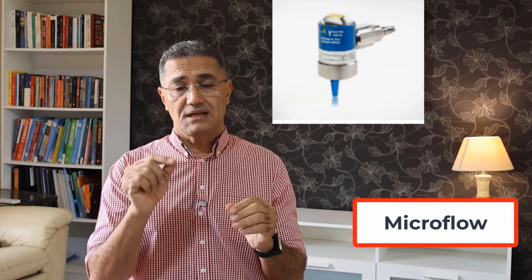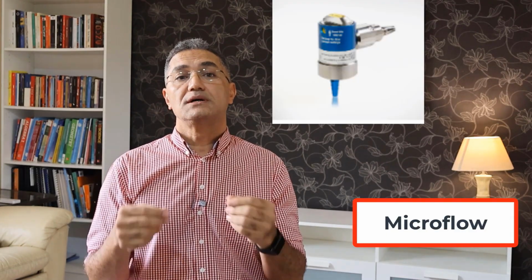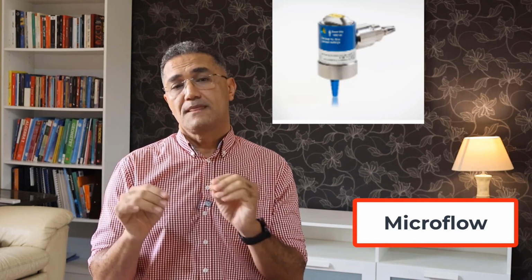Each grade of flow is connected, and it is the only one that does not have an oxygen blender because it contains automatic devices. You can adjust the FiO2 according to the flow you are using, starting from 0.8 liters for each level. This allows you to set the FiO2 to about 55%, which is a high percentage, and then you use the adjustment. Each flow level has a fixed corresponding FiO2 value. You cannot change it. Why do I use this option?